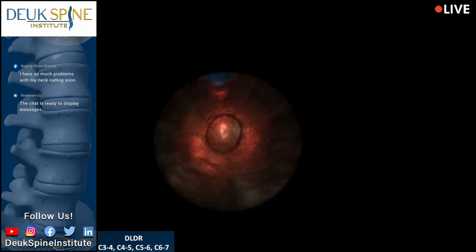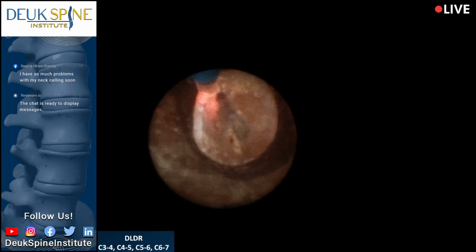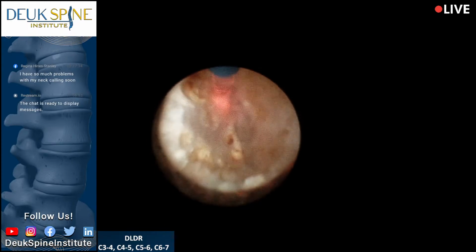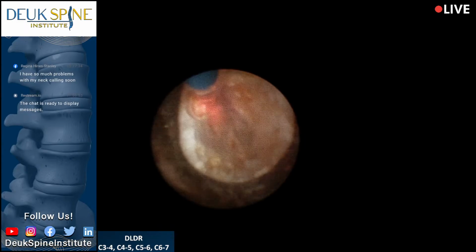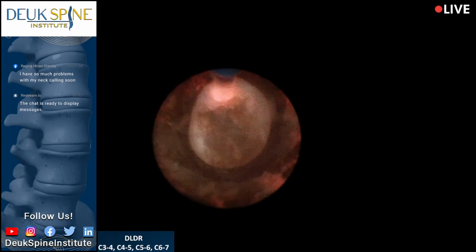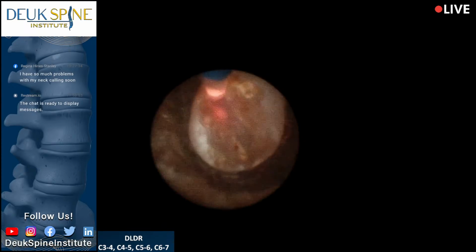All right, back the other way. We're just going to go back and forth, and I'm going to hopefully get some movement. There's a little bit of movement. And look at this, it's all scar tissue from inflammation, calcified scar tissue. So it's a herniation. It's nucleus pulposus that's sitting within the annulus, and quite literally, as it sits there, it creates an inflammatory response, inflammation we call it, within the annulus. And that inflammation just causes so much pain, but also it causes scar tissue and bone spurs, and that's what we got right here. I'm removing herniated fragment like that right there, and I'm removing scar tissue, and I'm removing bone spur.